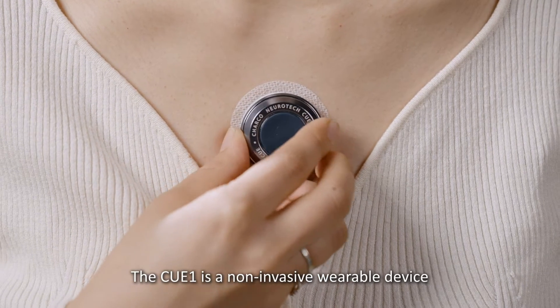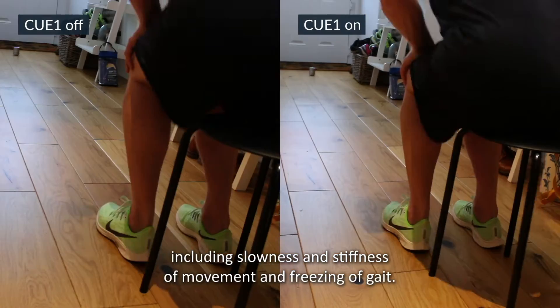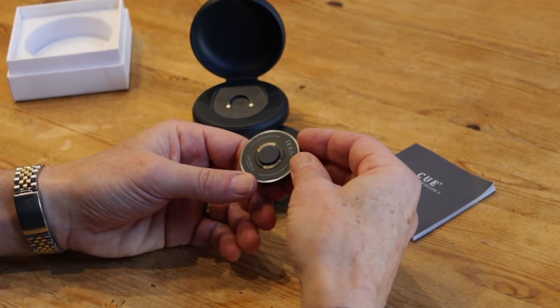The CUE1 is a non-invasive, wearable device that uses vibration to alleviate a range of Parkinson's symptoms, including slowness and stiffness of movement and freezing of gait. In this video we'll go through how to set up and start using your CUE1.